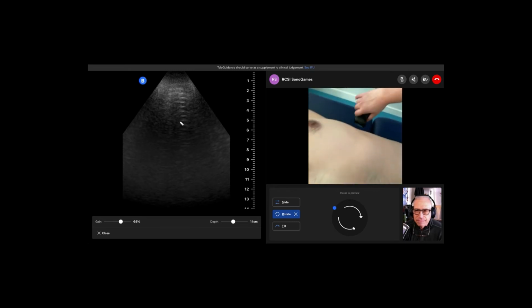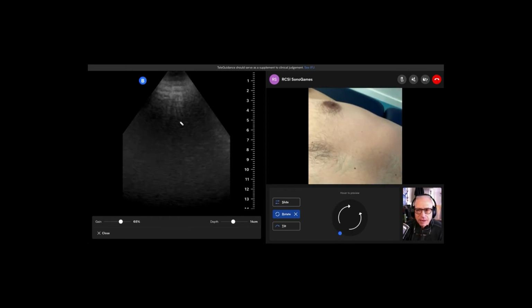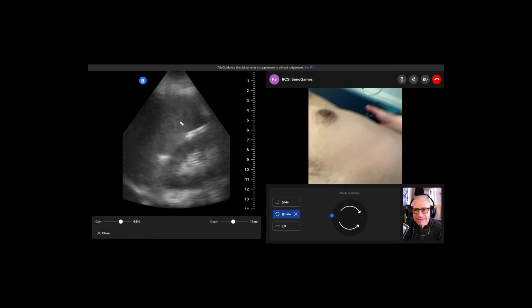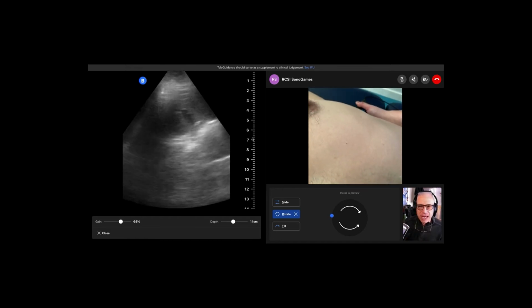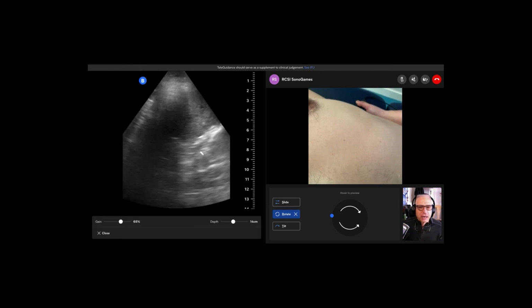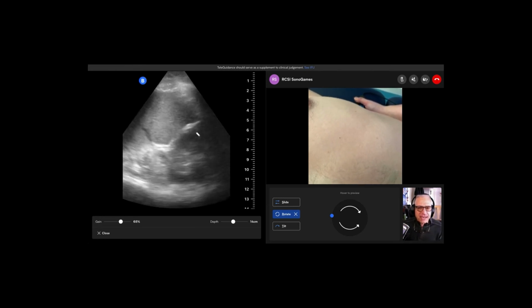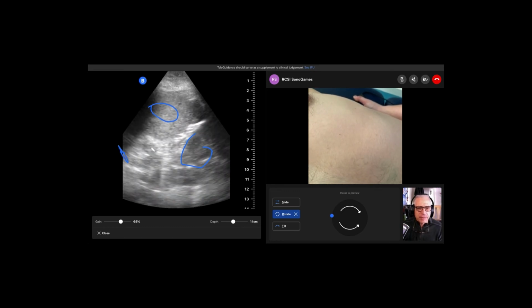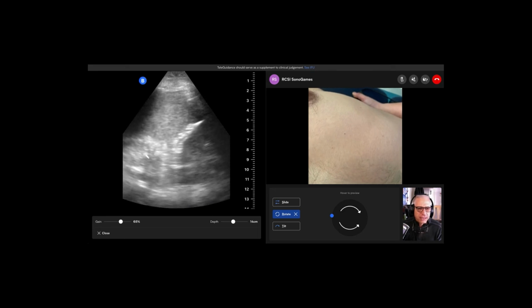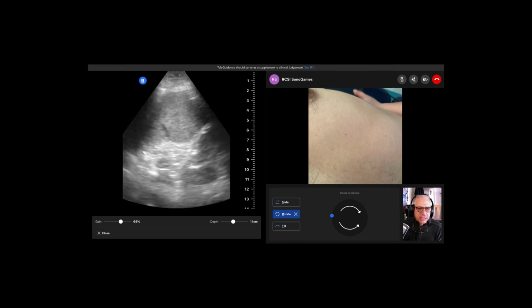Okay. Let's see if that was enough. Oh, you can never have too much. Super, look! Oh my gosh, that was perfect. You just had the most perfect image ever. Oh, that is fantastic. There's your kidney, there's your spleen, and you have a little bit of diaphragm coming over here. So try sliding just a hair north towards the head. One more rib space. Okay.